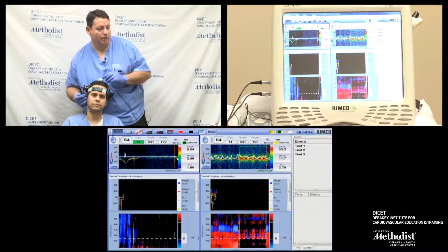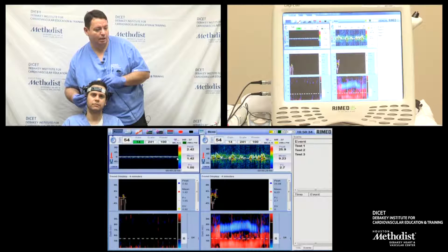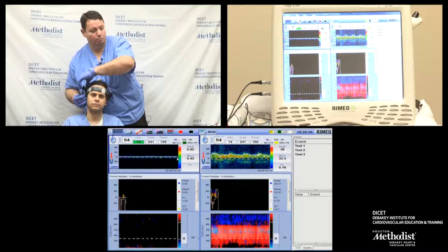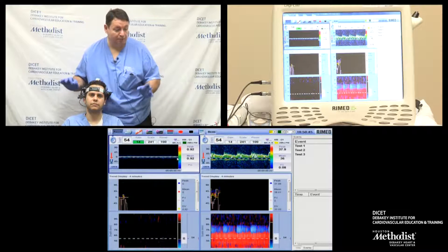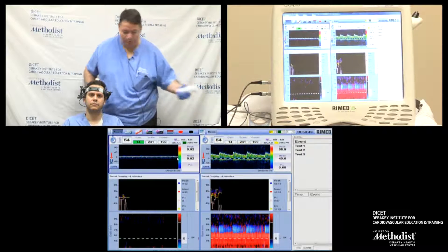Right away, I'm looking at the middle cerebral artery at a distal portion. This is probably a perfect signal for me. So I'm going to pull my lock, and I locked it in position. I'm trying to monitor my signal around depth 50 — that's the best depth for my middle cerebral artery.